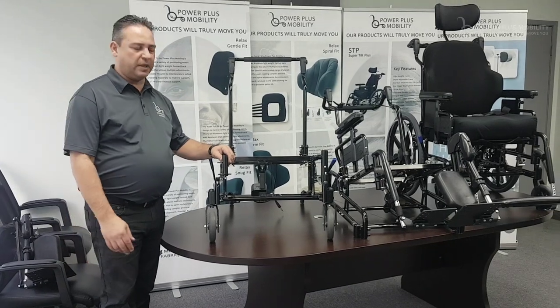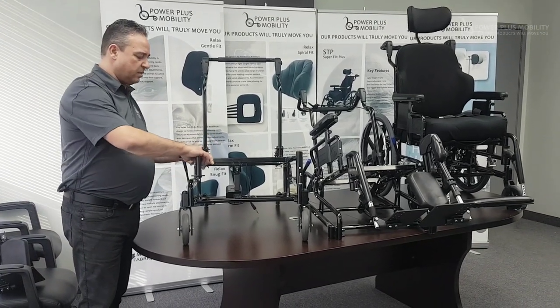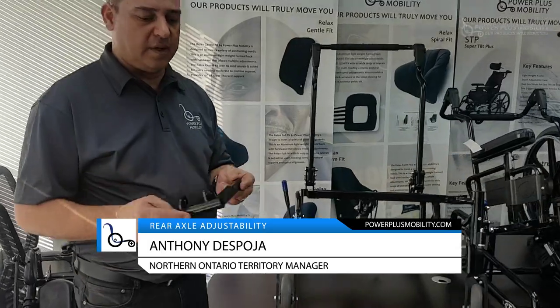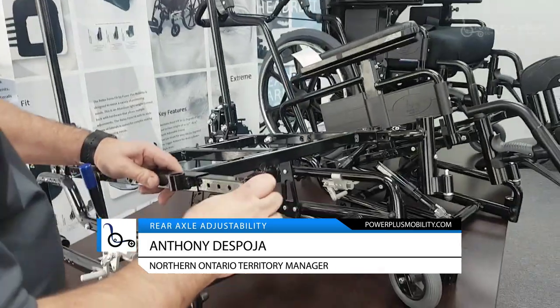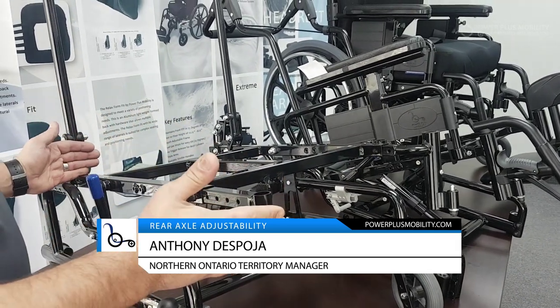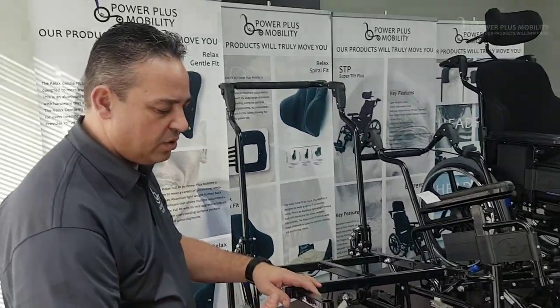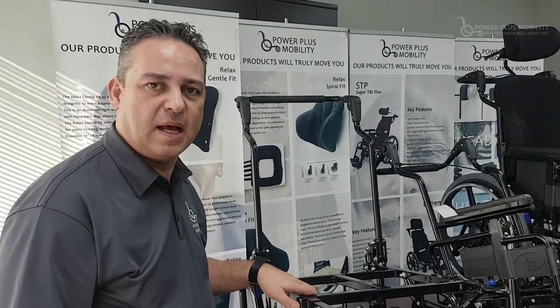The first one I'd like to start with is something that originated in this industry which is called pin and saddle. Each one of Power Plus's chairs has a hanger and this is what we call a hanger sleeve. This is mounted and easily moved up and down on the chair, which allows us to accommodate the total depth of the chair, and that's universal to all the mounts I'm going to show you here today. But specifically these two pins here represent a different style called pin and saddle.